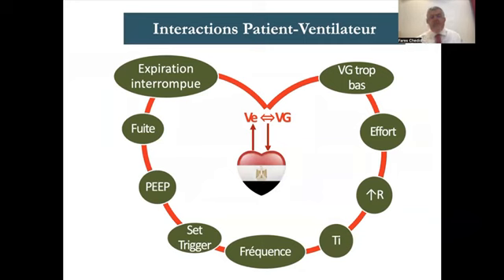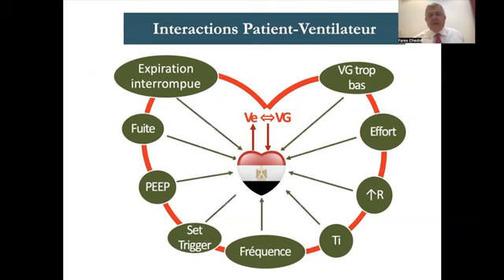And with this, I finish the talk to tell you that this relationship of love between the PIP and the expiratory volume of volume guarantee might not stand more than one day, like the marriage of Rushdi Abaza and Sabah, because there is so much interference on the way. So please, when we put a patient on volume guarantee, it's important that we go around him quite frequently to see if any of those elements are affecting him, which I explained.